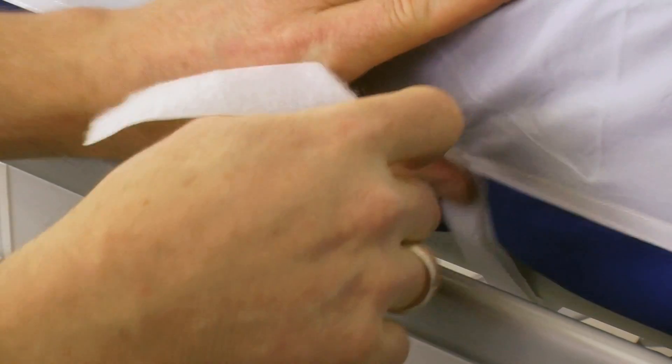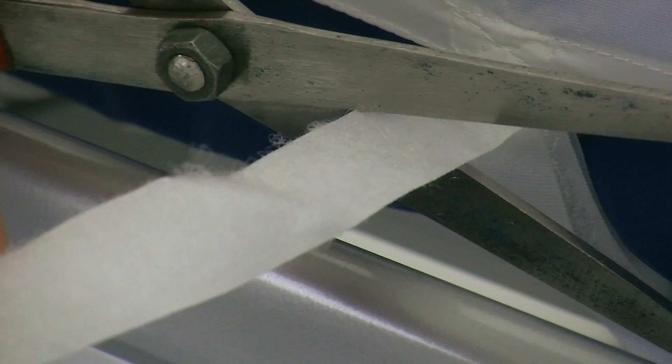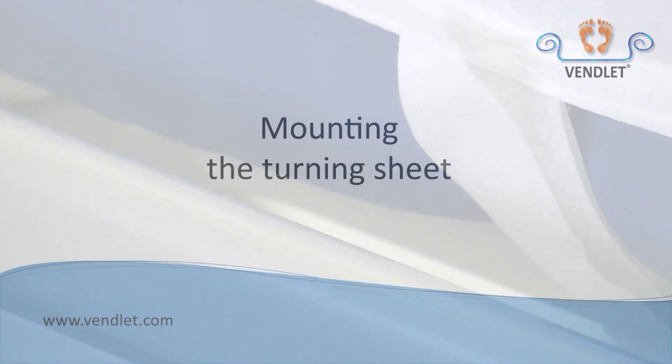The tapes are sufficiently long to reach even when thicker mattresses are used. Surplus tape should be cut off to avoid any inconvenience.